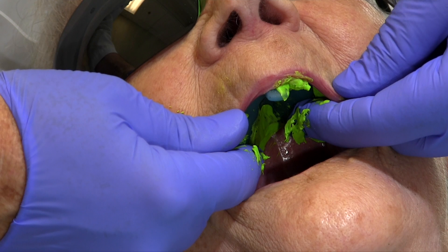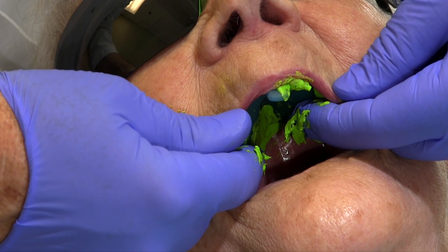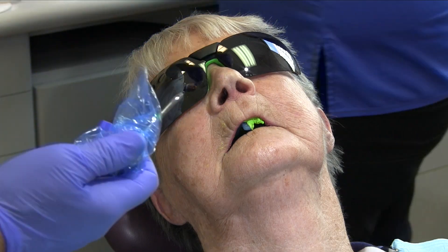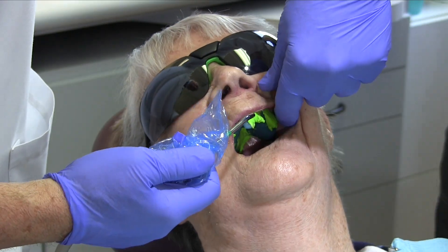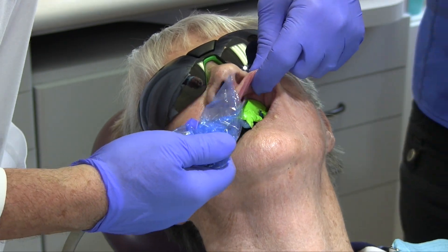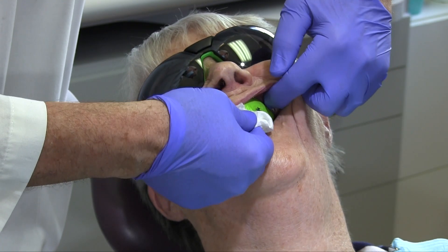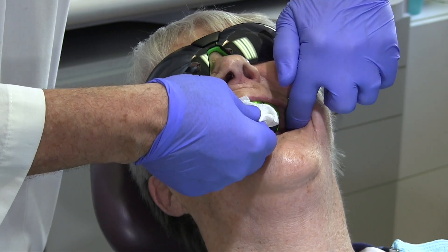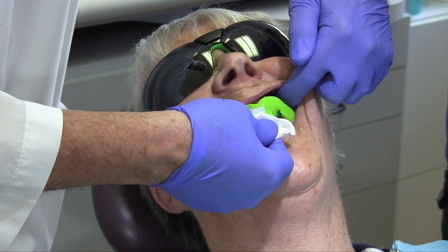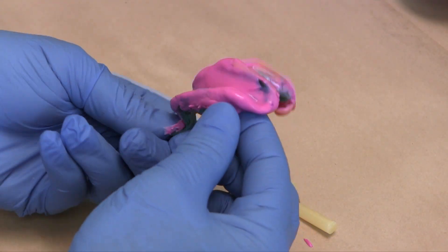Stabilize the impression without pressure while it sets so it does not move and distort. Never leave a patient with a tray in their mouth, as they could aspirate material or become distressed without help nearby. To remove the impression, pull up the patient's lips and cheeks and place a few drops of water at the edge of the impression. Move the patient's lips to help break the seal. Before removal, use the tray handle to slightly rock the impression up and down until you hear a break in its seal. Then remove the impression quickly to minimize permanent deformation. Inspect the impression for accuracy, coverage, and absence of voids.